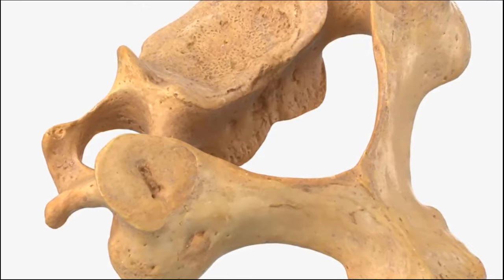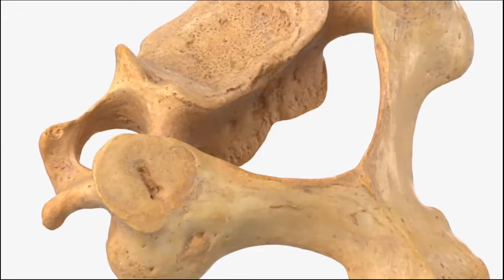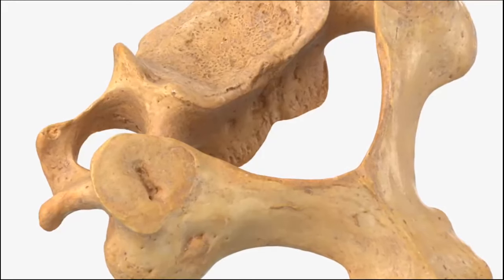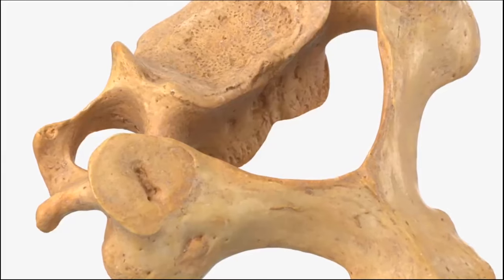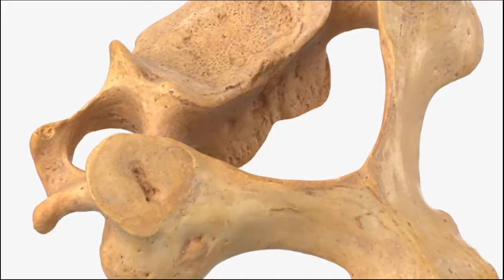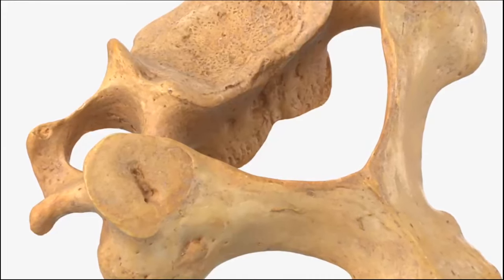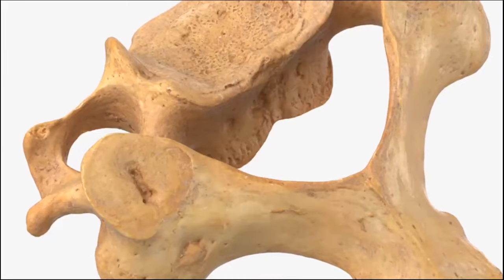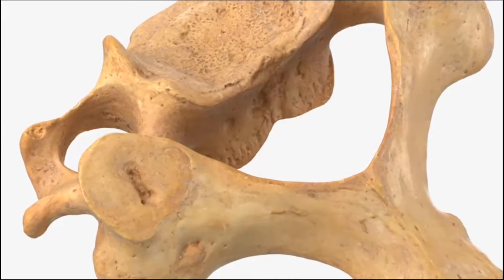The two ways in which the vertebral artery can get injured are, number one, if one strays beyond the margin of the vertebral body towards the foramen transversarium, especially if one is using monopolar forceps to dissect out the longus coli muscles on the two sides. The second way is by an oblique drilling of the vertebral body. In this case, the vertebral artery is likely to be injured not at the superior or inferior aspect of the vertebral body, but rather in the middle part as the drill breaches the foramen transversarium.